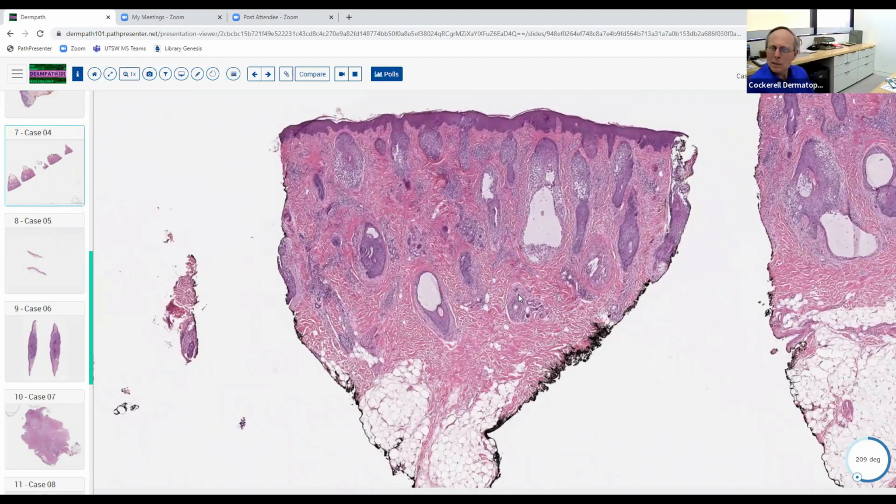It doesn't have as many sebaceous glands as most face biopsies, but it could be an individual that just doesn't have a lot of sebaceous glands, and still could be near their face. So yeah, possibly close to the scalp. I mean, some of these are fairly deep, but maybe they're shifted out of anagen. Maybe it is the scalp and they're just shifted into another follicular stage, if you will.